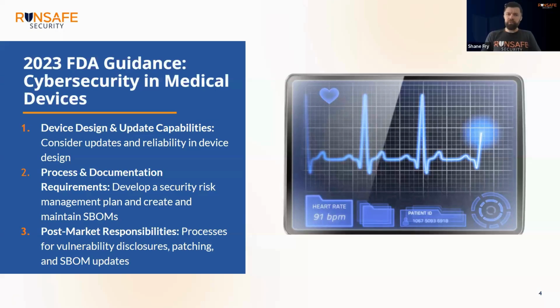Yeah, so you think about those devices, and they're more embedded devices. They're not web applications largely running Node or Python, where you can easily generate a software bill of materials. And there's a lot of tooling today that can do that. But when you get to the embedded devices and you're doing Yocto and you're doing C, C++, there are very few tools out there today that can give you a good, accurate software bill of materials for that.